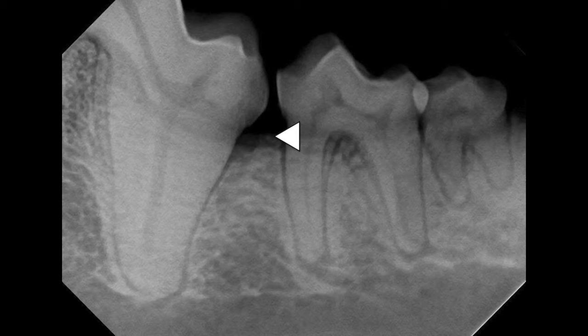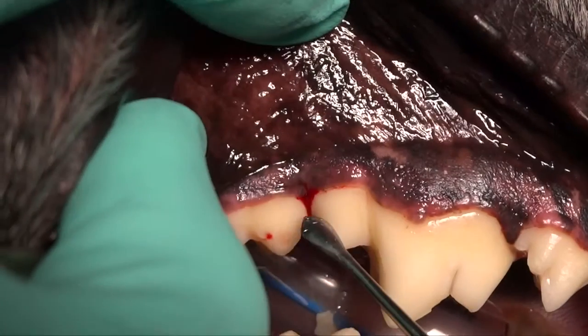However, there's granulation tissue in that defect that, if left untreated or not removed, would progress to the point where later down the road — six months to a year — that defect would become more significant. So we need to treat those.